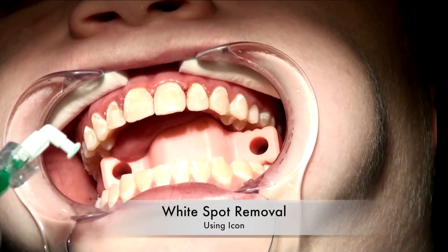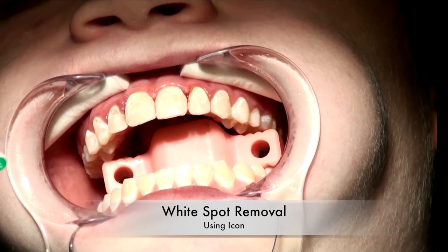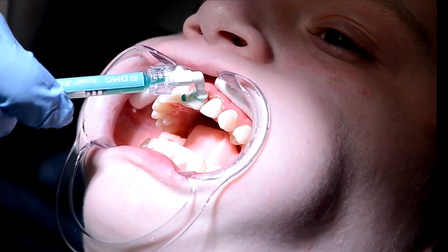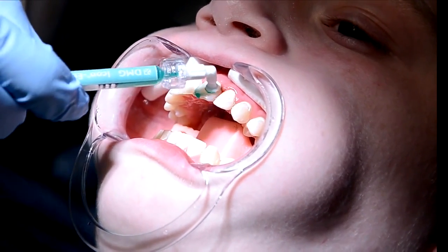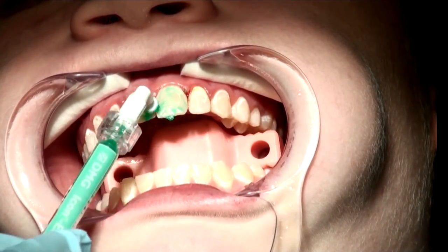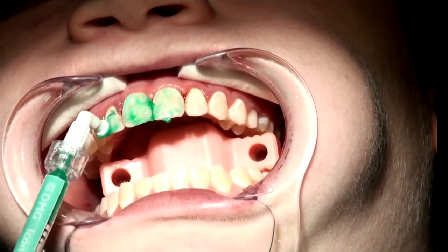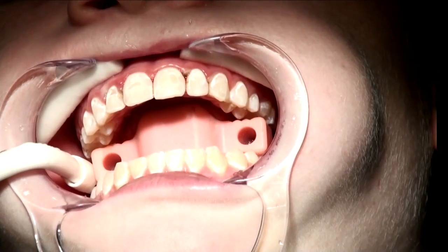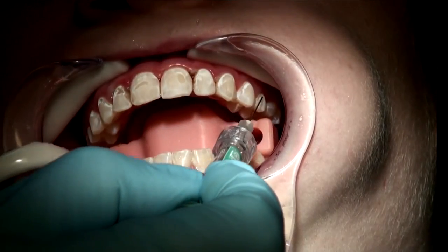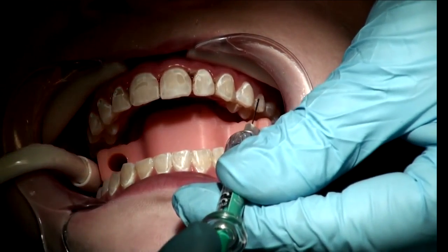This is the etch, and it's applied with a special applicator tip. As you turn it, it comes out the end. You want to focus on applying it all throughout the area. Prior to doing this, Jason had a liquid dam placed around the gums, and everywhere we see a white spot, we're going to treat. After you've etched and rinsed everything dry, the Icon Dry is applied for 30 seconds.